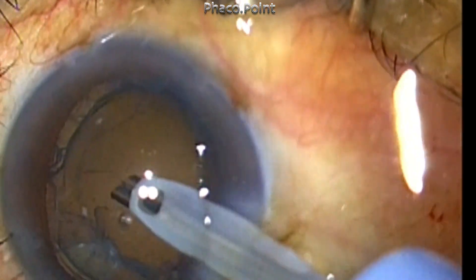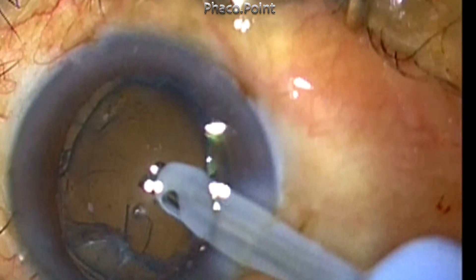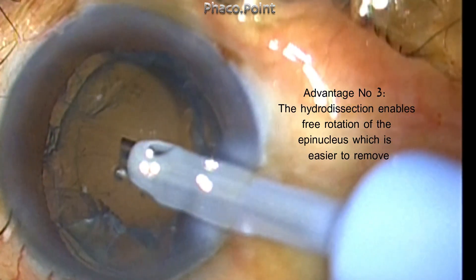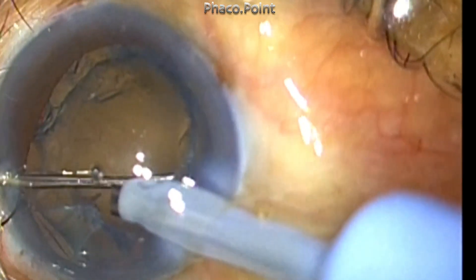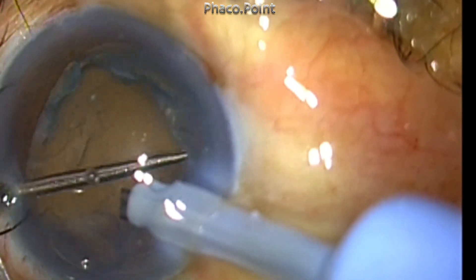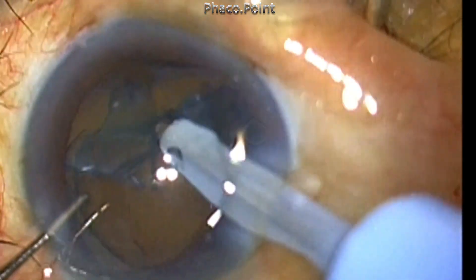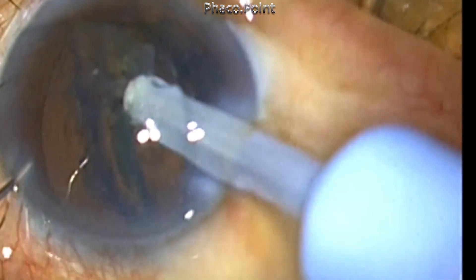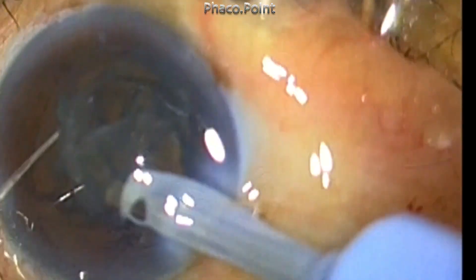This leads to the third advantage: when you combine the cortical cleavage hydro dissection, you will have an epinucleus that is freely rotating. A freely rotating epinucleus will be much easier to remove because it will be mobile and get easily aspirated into the phaco probe.